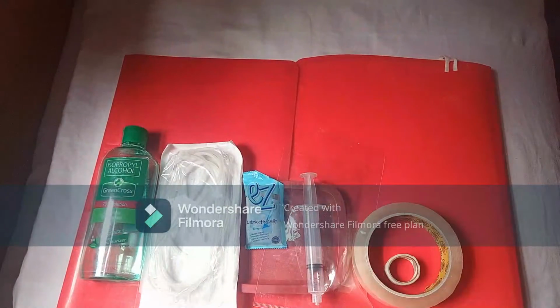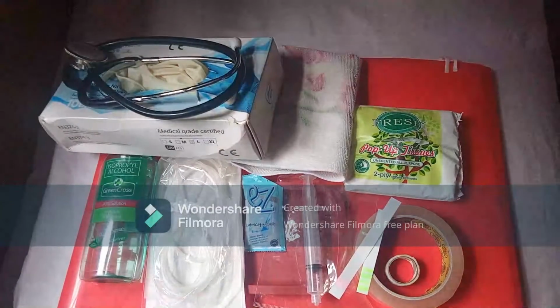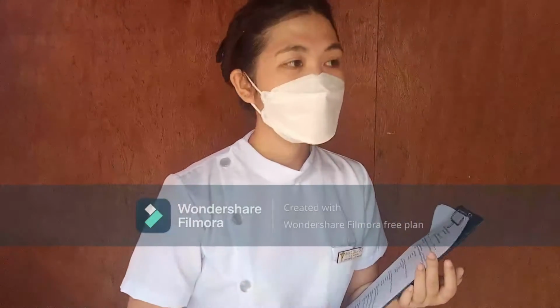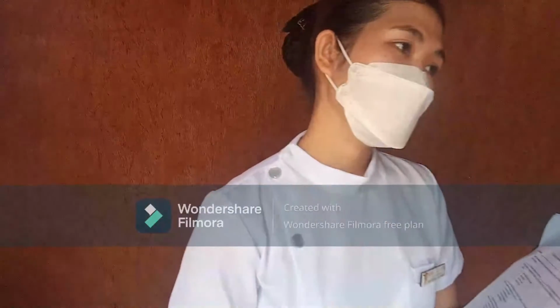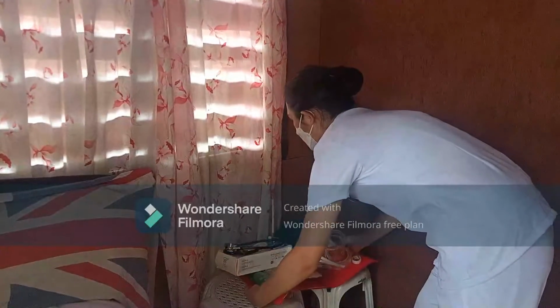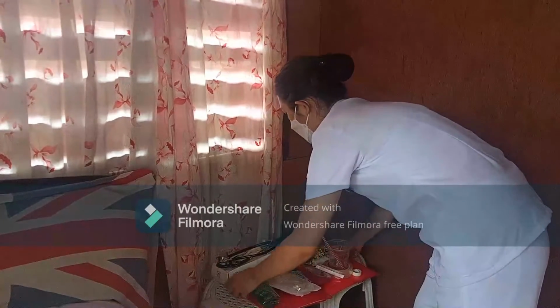In planning, identify the availability of needed supplies and equipment. Then, arrange for extra nursing personnel to help as necessary. And then lastly, prepare equipment and bring preparation to the bedside.